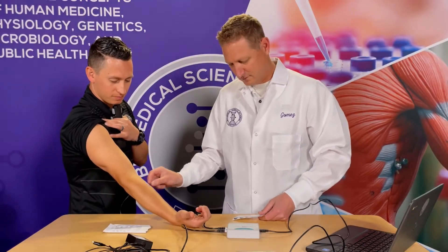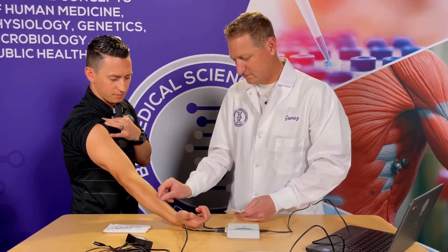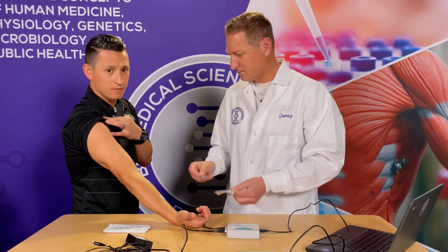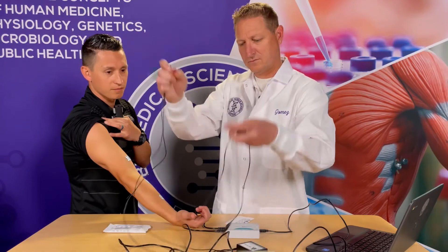Attach three electrode tabs to the arm of the subject. Two tabs should be placed on the ventral forearm, 5 centimeters and 10 centimeters from the medial epicondyle, along an imaginary line connecting the medial epicondyle and the middle finger.